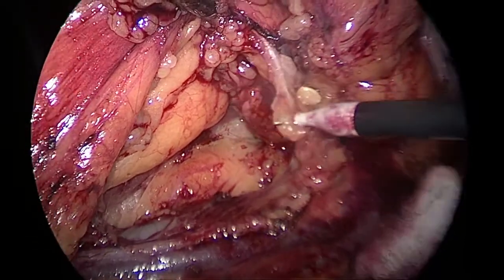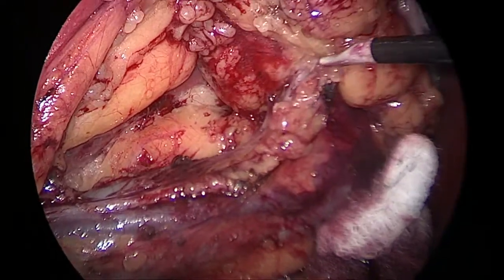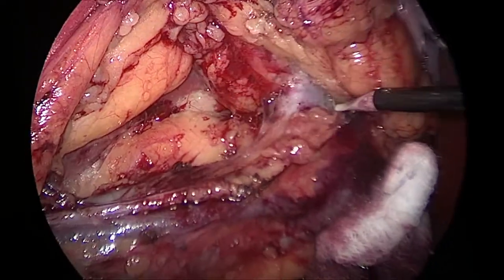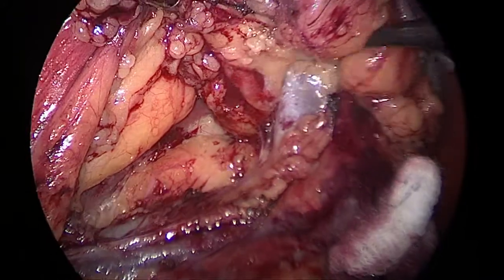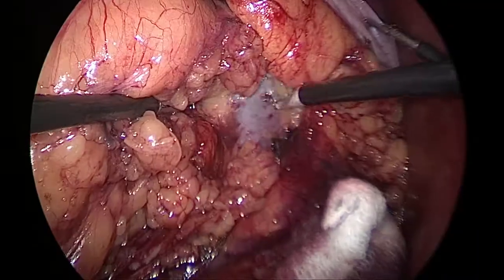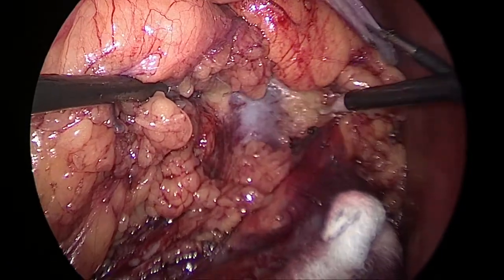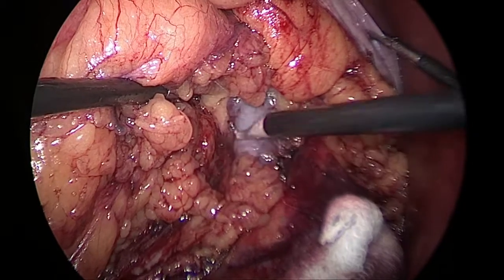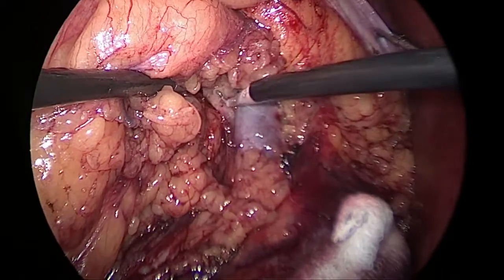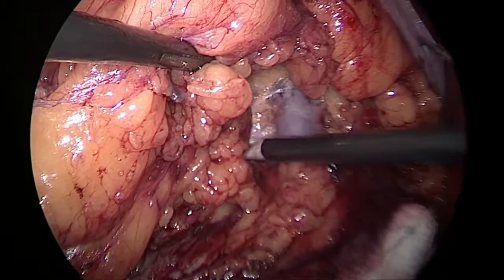Simple monopolar hook is good enough to dissect the hilum. You can see the renal vein now. Whenever you get the renal vein, you will get the renal artery immediately behind the renal vein.